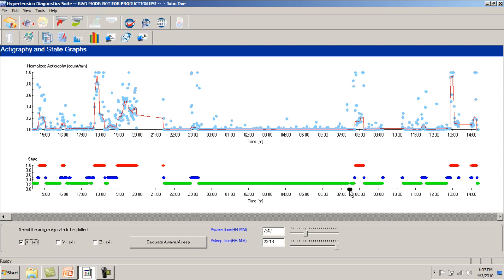The start of the longest restful period, the green display, is used by the software as the start of the asleep period and the end of this period as the awake time. In case corrections need to be made, these values determined by the software can be overridden using the slider bars or entry data values on the bottom right.